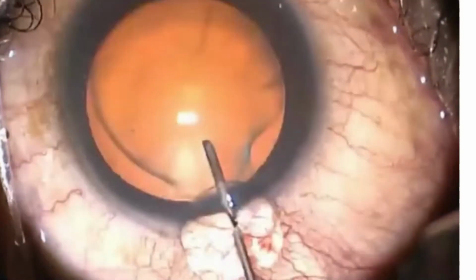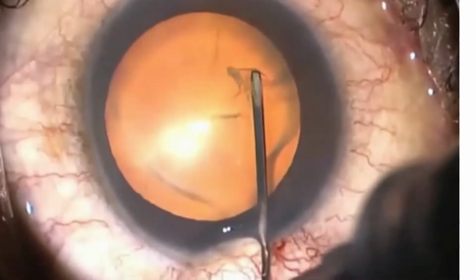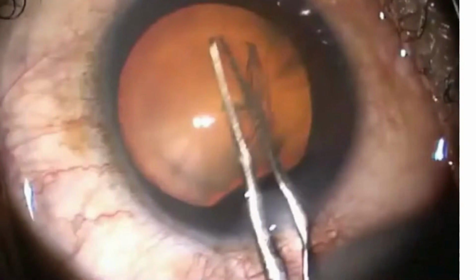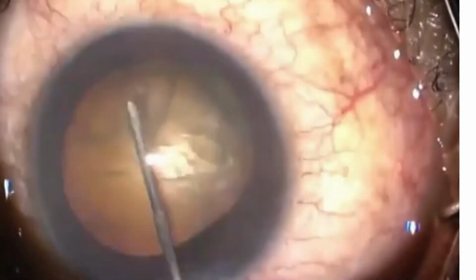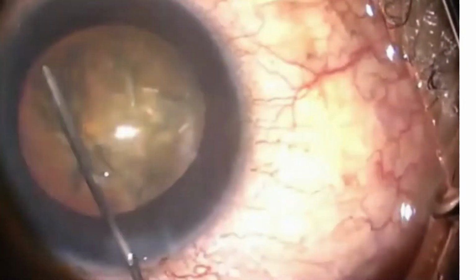During horizontal chopping, the nucleus is secured between the chopper and the Phaco tip, which makes this technique less dependent than others on vacuum level. The capsulorrhexis must be 5 mm wide to allow surgical maneuvers to be performed without causing damage to the capsule. Hydrodissection is mandatory, and hydrodelineation is advisable.